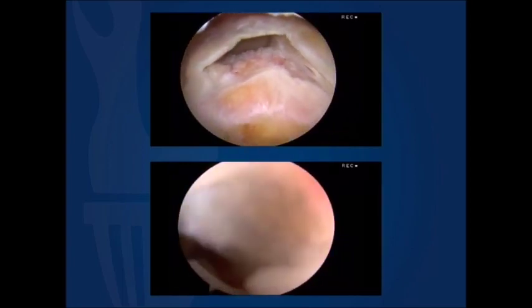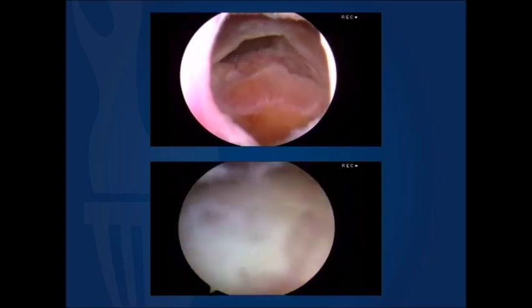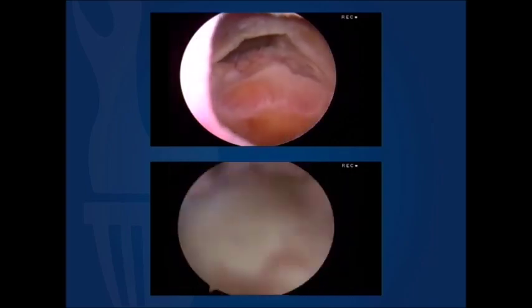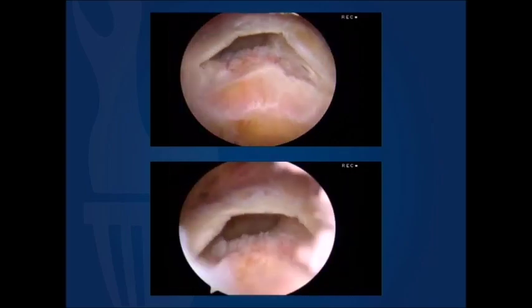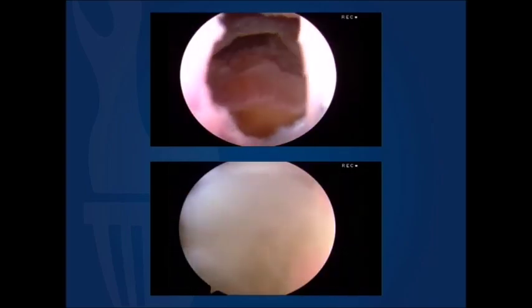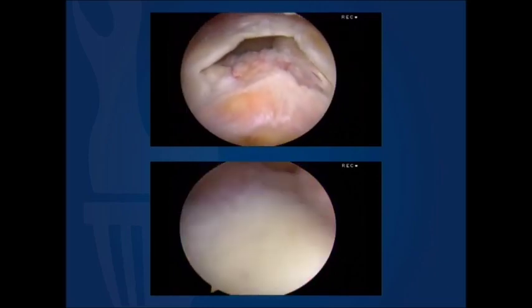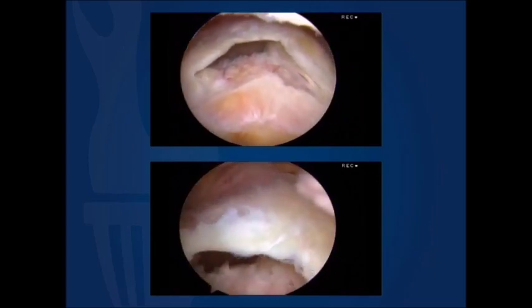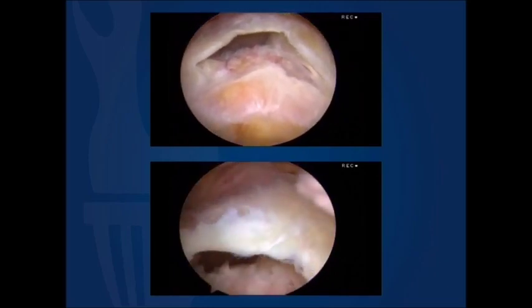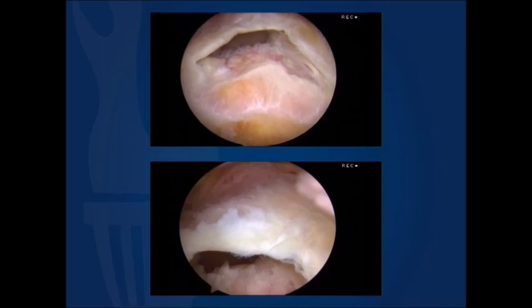Now compare that with the video below, which is the same video we showed earlier. As we try to back the camera up to broaden our perspective, there are significant limitations imposed by the fascia.